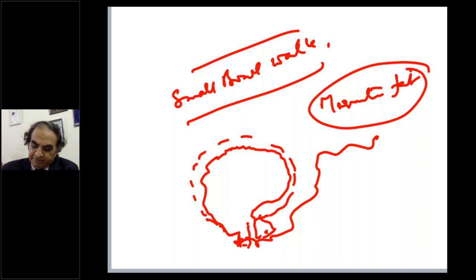The diagnostic laparoscopy pattern does not change. In addition, you do the bowel walk, which you do in diagnostic laparoscopy also. But once you've found a pathology, a lot of people abandon it here, which should not be abandoned. And a bowel walk has to be done very gently. That's what I wanted to emphasize.